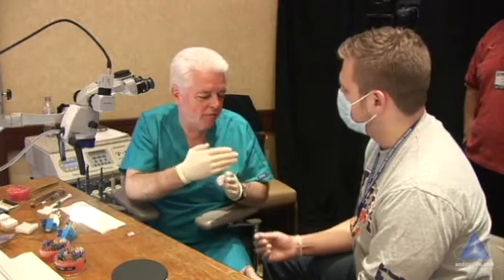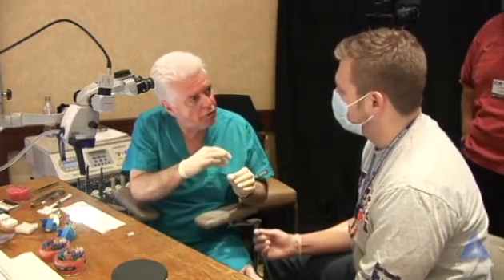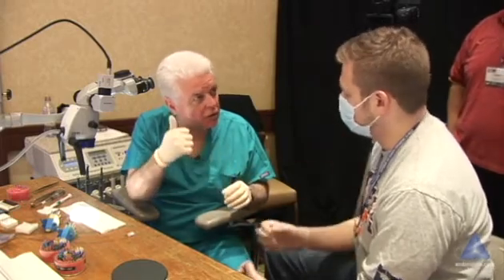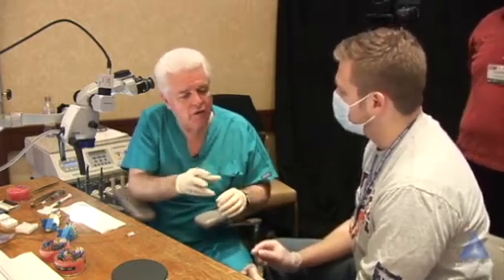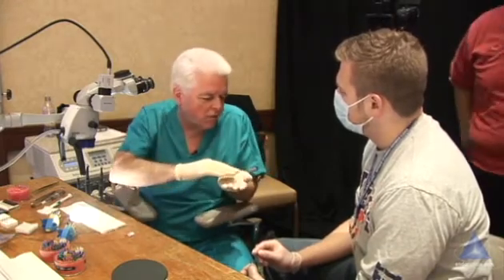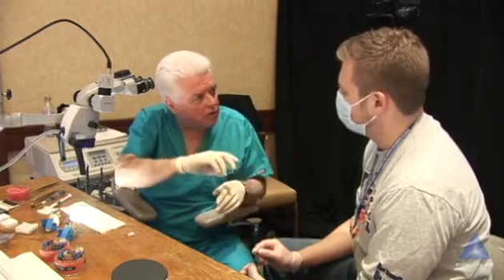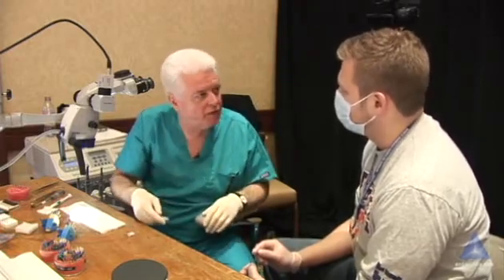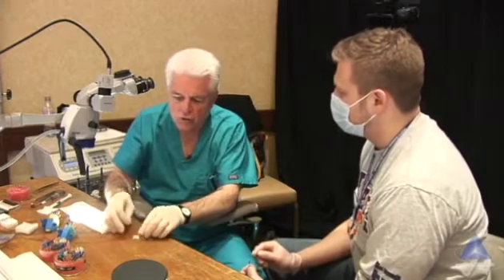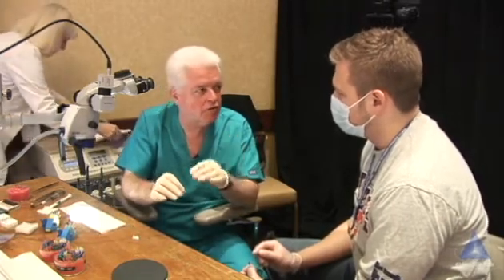Then finally, the blades in your file are starting to tap into dentin. So when you pull, you're shearing dentin on the outstroke, so you're cutting away. You might go down and it might not want to go. Well, then why don't you just lift the file up short of the impediment and do the little moves we've talked about. Maybe bring in a 15, make it just a little bit bigger, but immediately try to open that thing up. Then you'll be able to put a curve towards the tip of the instrument, and now it'll stay curved as you go through that pre-enlarged region.